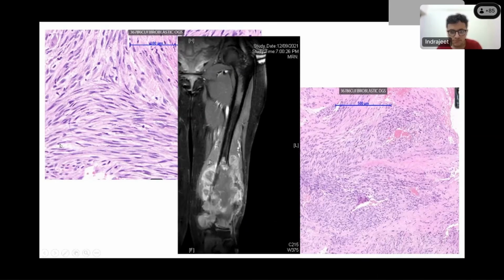If you look at only the histology without any radiology image, you would wonder whether this is something very low grade, a spindle cell tumor. On close look, you might see some hyperchromasia, but not much nuclear atypia, not very many mitoses. But now this picture comes in front of you, and anybody can recognize that it is a highly destructive, aggressive bone neoplasm, right?